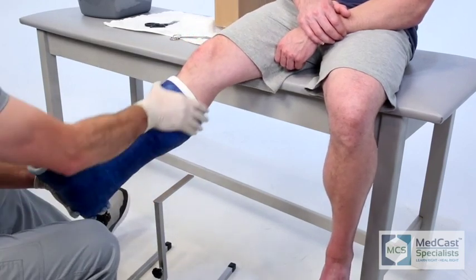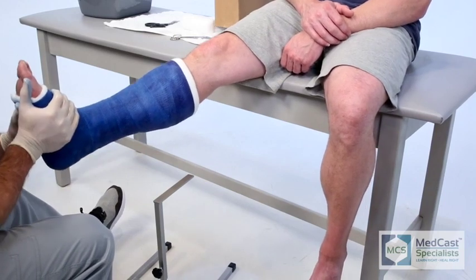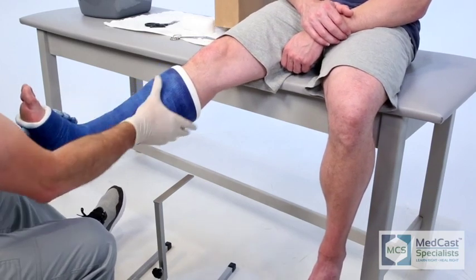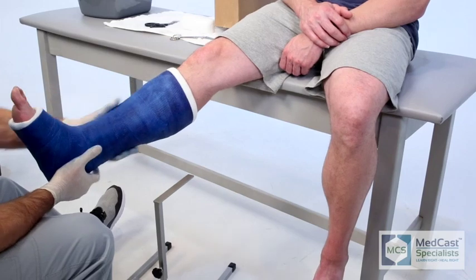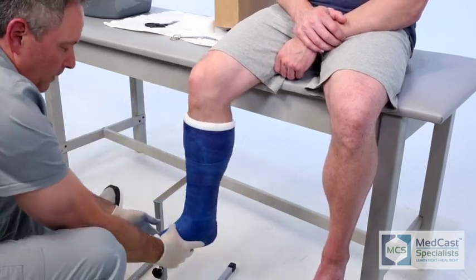Now we have a short leg cast at 90 degrees, good distance between the popliteal area and also down below the fibular head, and good toe movement without any impingement.